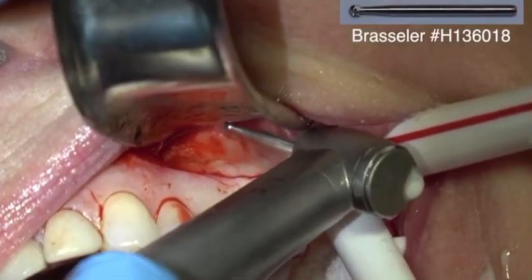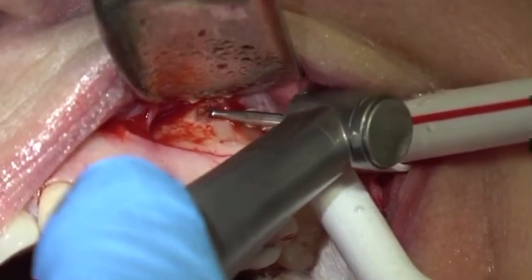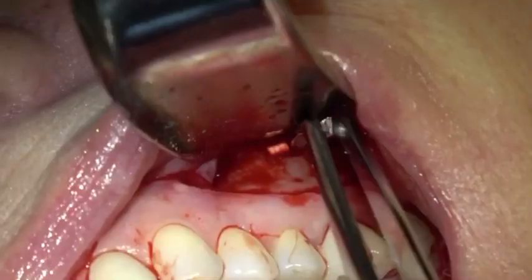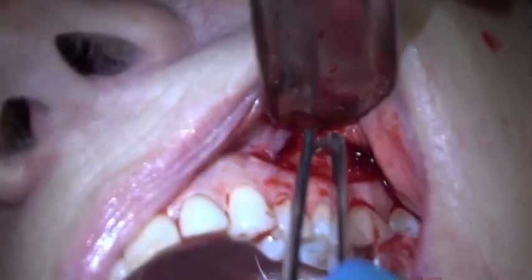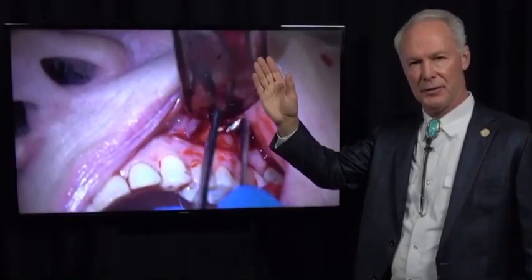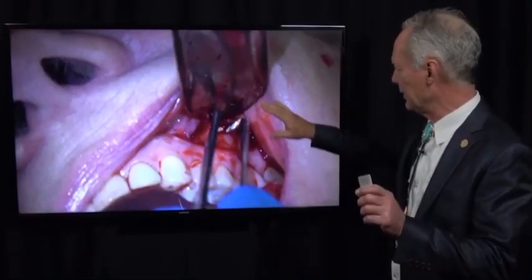This is a high speed number four round burr with a long shank. Now to be sure I'm in the right location, I'm taking a little piece of gutta percha — this is a hot tip — and I'm going to place it in that beginning ostectomy and take a radiograph. You can see there's the root and there's the gutta percha cone, so I know the root is right there. Sometimes the roots are not directly apical to the crown of the tooth, and you want to be sure you're performing your osteotomy in the right location.